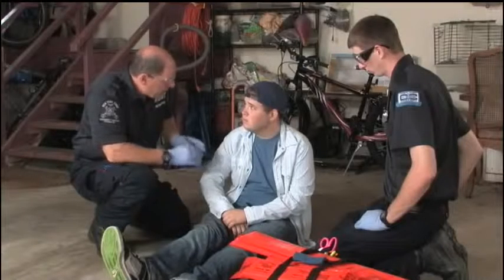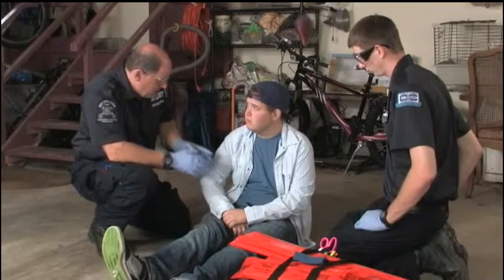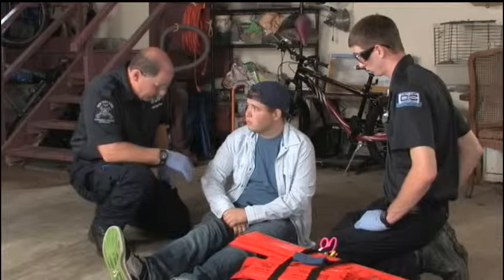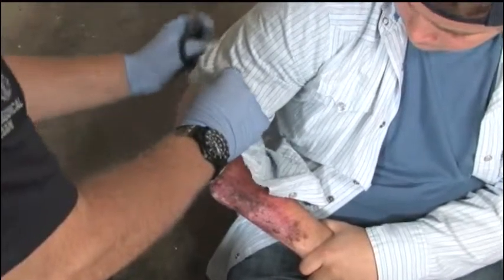Take BSI precautions. Explain the splinting procedure to your patient, gaining his or her consent to perform the procedure. Any kind of manipulation of the extremity may be painful. Prepare your patient for the temporary discomfort, assuring him or her that immobilization will minimize pain thereafter, as well as prevent further injury. If possible, expose the area to be splinted.